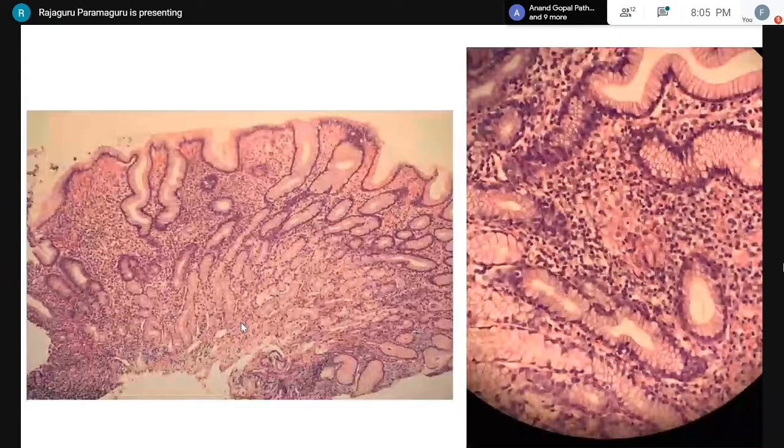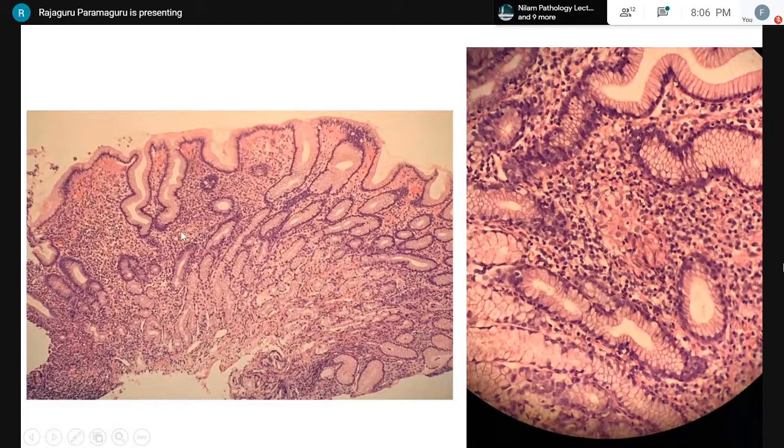This is a photomicrograph showing a gastric granuloma, where you see the inflammation is increased in the lamina propria, and this particular area didn't look so nice. On high power, this showed a granuloma here. If you are not so sure about this, always request your technicians to do serial sections and deep cuts. Serial sections are always better, and you can demonstrate that the granulomas are increasing in size, that they have some substances within them, or whether they are caseous or not. So everything will be clear when you do a serial section, so don't hesitate, and always get a serial section done for such findings.